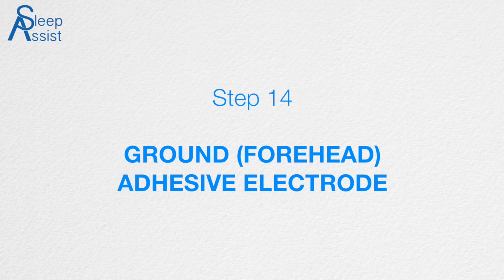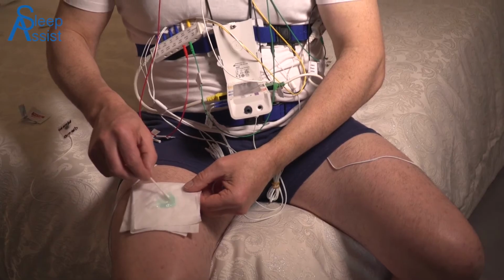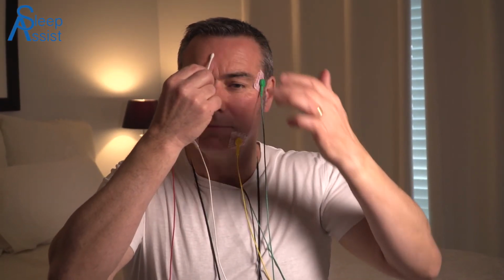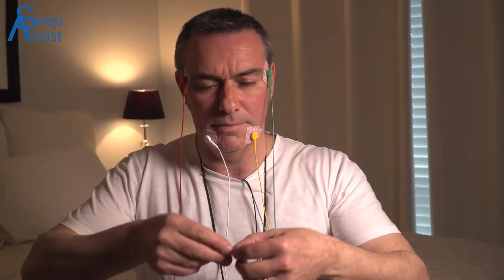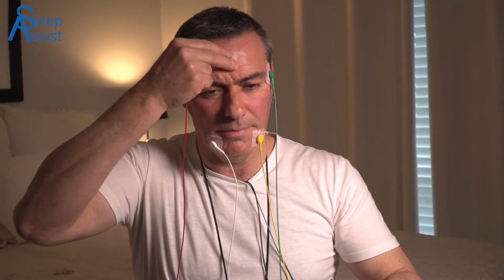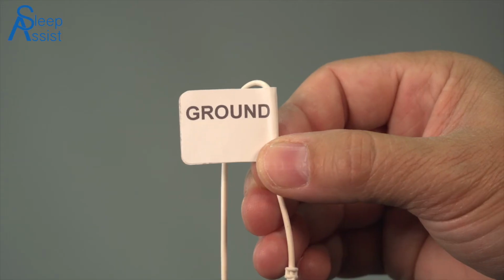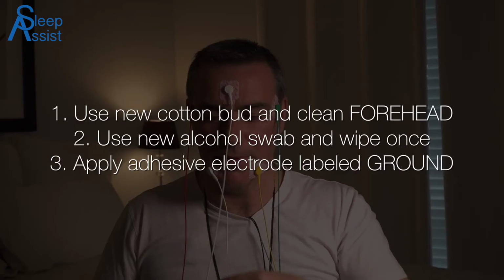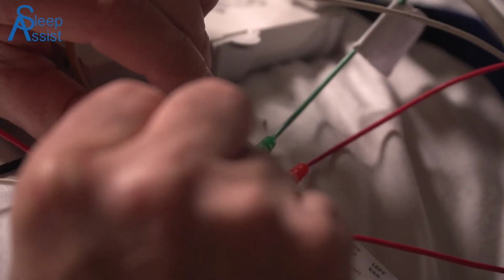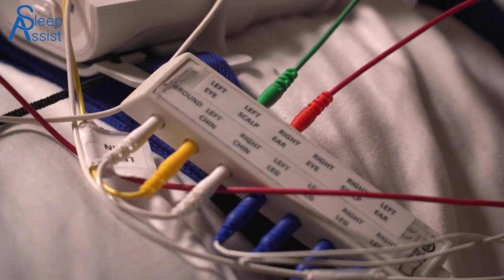Step 14. Ground forehead adhesive electrode. Using a cotton bud dipped in Nuprep, clean a patch of skin on your forehead the size of a 50-cent piece, rubbing with the cotton bud for 20 seconds. With a fresh alcohol swab, wipe the area clean with one swipe only. Apply the adhesive electrode labelled ground. Insert the lead marked ground into the multi-lead port box labelled ground.